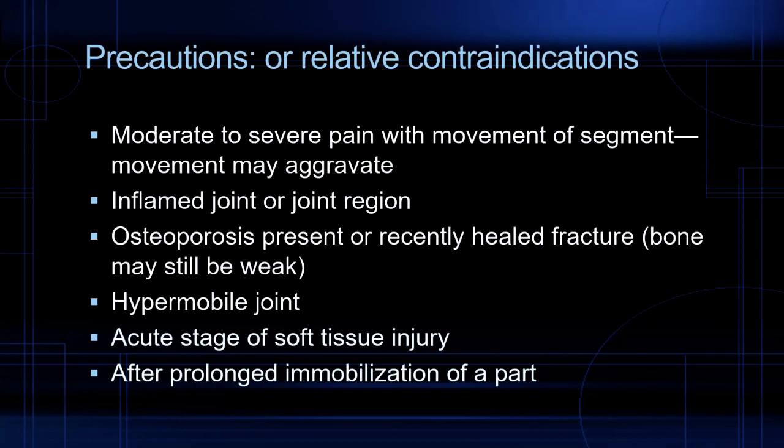Also, if they've been immobilized for a long time, you are going to find most likely that they're fairly stiff. So you will be wanting to measure their joint range of motion, but you're going to go slowly and use care if it's painful. Okay?